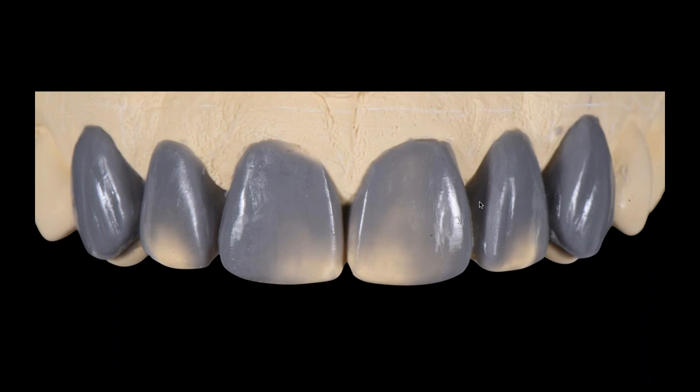And by the way, from an aesthetic point of view, I always manage cases that way. I look at them where I want to do 2, 4, 8, 10, or 12. I don't really like to do 6 teeth because of the color change and the deviations in the arch form. So for me, 2, 4, 8, 10, 12s rather than 6s. But in this case, we couldn't have done the 6s unless we did more and we started changing the occlusal patterns of who he was. We didn't want to do that.